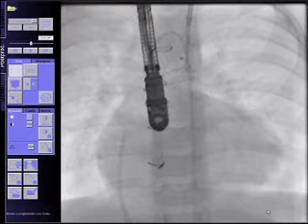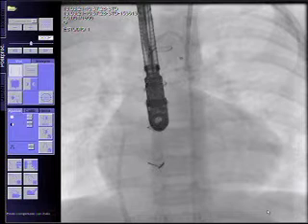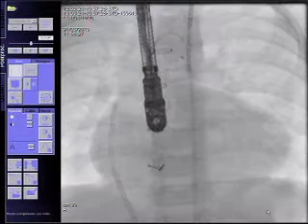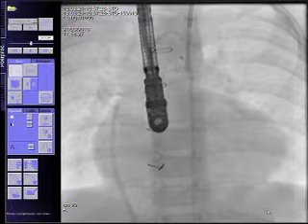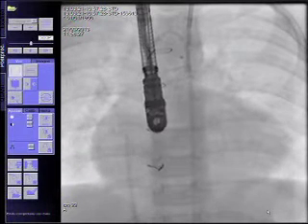You see that? Too low. Ahí está bien, pero está... It looks good on lateral, not on PA, and not on echo. Okay.